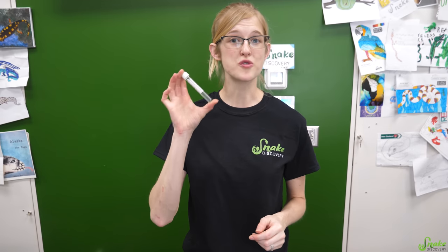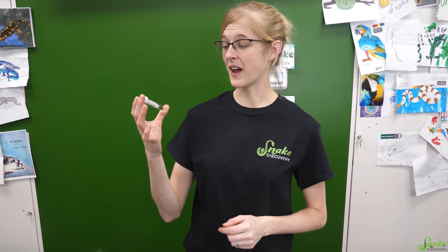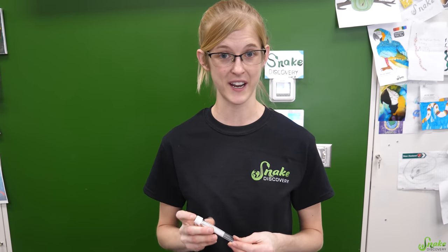So there's different purposes for each type of injection. Let's start with how to draw medications from a vial. Before we do this, we just want to mention that we do not condone self-medicating or self-diagnosing your own reptiles' health issues. This is really just a tutorial video to help you if you already have a prescription from a vet that you need to inject into your pet reptile.